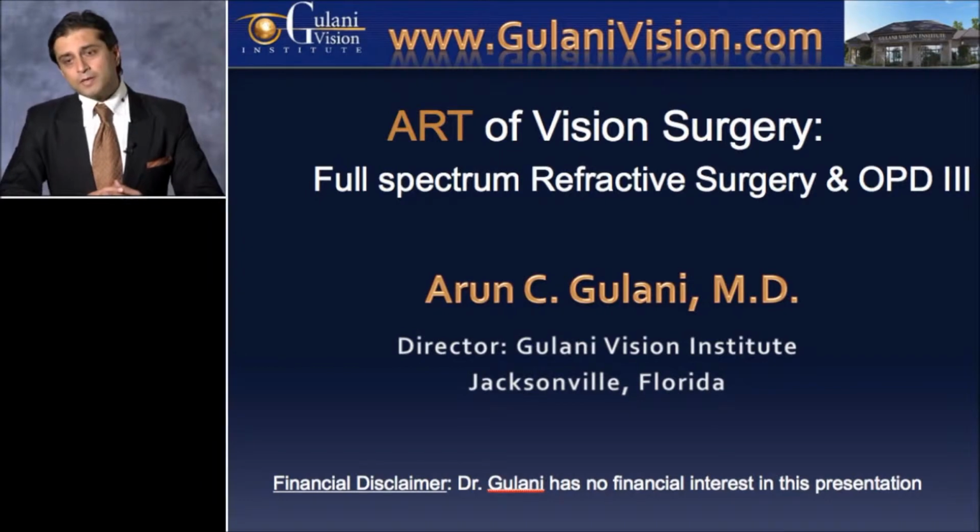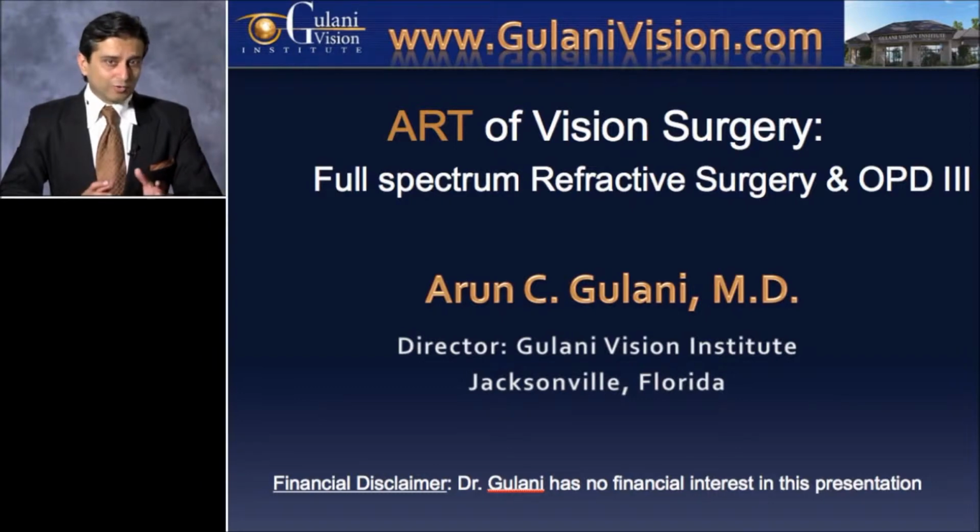come about it. But talking about technology, I think the need of the hour has been and was something like an OPD-3 that would bring in all this data in one platform. So a patient sitting at one single station, we can detect all this information, take it to us in the consultation room, show the patient on screen what exactly you're seeing.